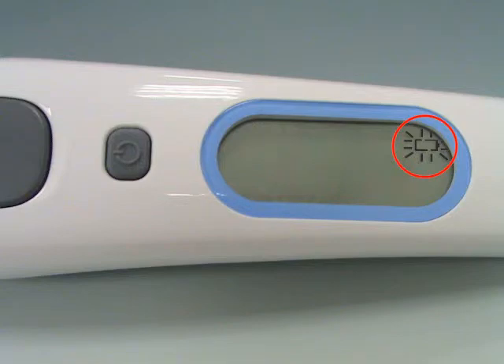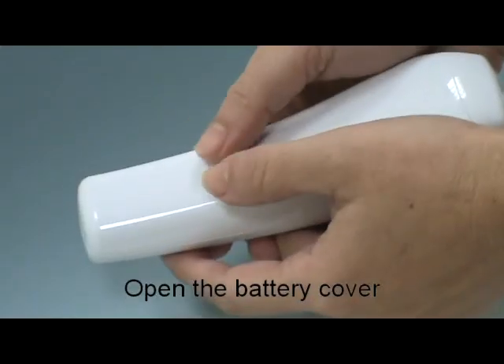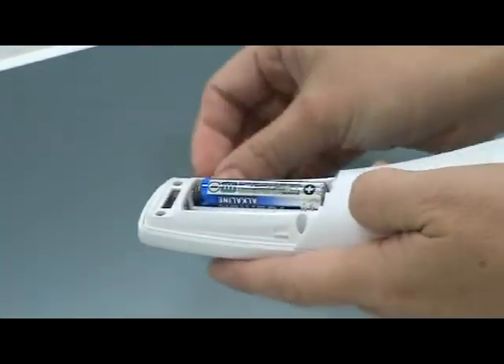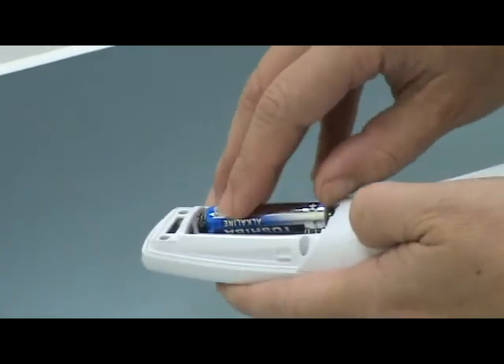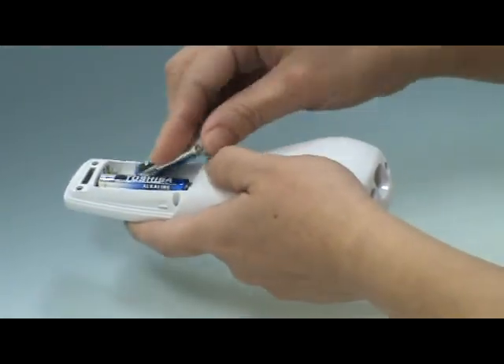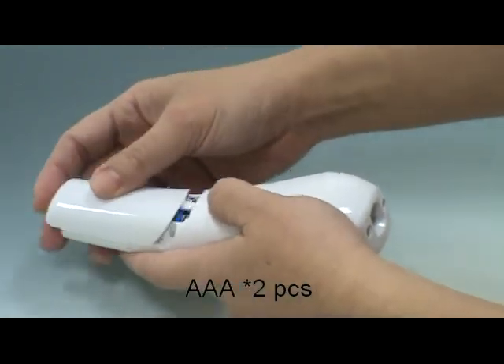When the low battery icon appears, please change the battery. Use your thumb to push the battery cover out. Hold the thermometer and remove the batteries. Insert the new batteries and replace the battery cover.